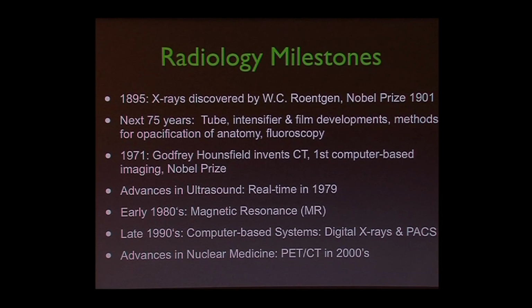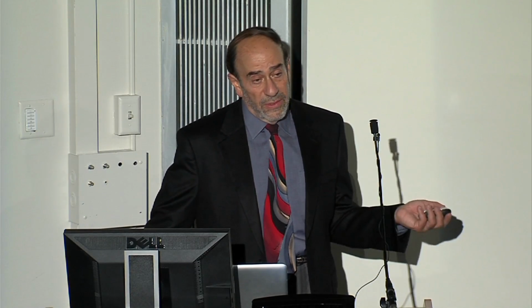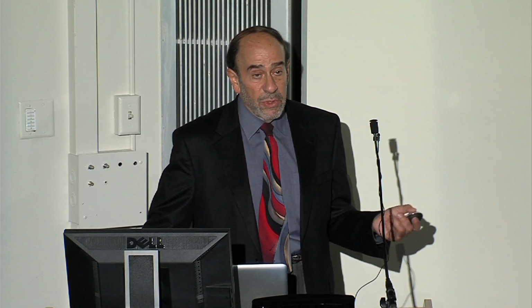And from then on, the computer really had a lot to do with all the tools that we use today: ultrasound, MR scanning, magnetic resonance, and then we got computer-based systems to view the images, to manipulate them, to transmit them. And nuclear medicine has been around for a long time, but some very modern exams like PET CT scans, which I'll talk about a little bit at the end.